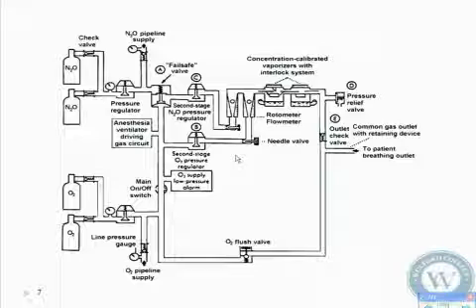What do you think your wall pressure is? About 50. Okay, so 50 psi. So that would be an intermediate pressure system. So if you ever ask a question about a high pressure system, it's always going to be your cylinders.